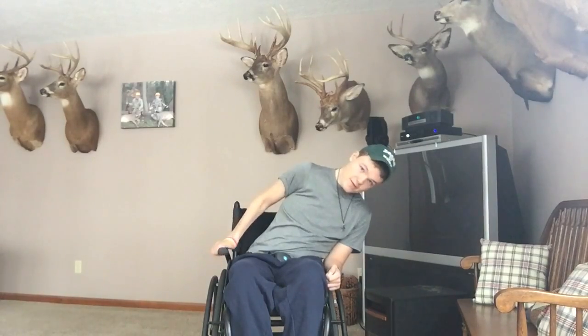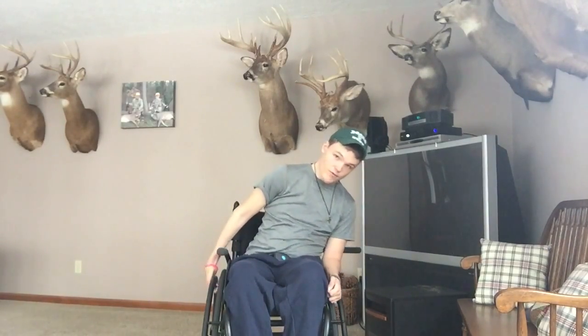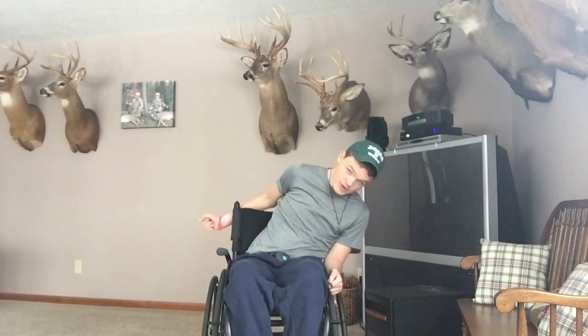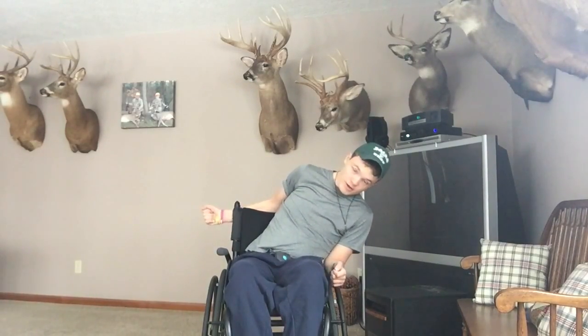Once again, if you have an armrest, you can use that, or if you have a push rim, you can use that. But my probably favorite way to do it is to just hook my arm under this handle and pull myself back up. If you want to practice doing this, or you do not have the ability to do it unassisted, you can lean up against a surface such as a table.